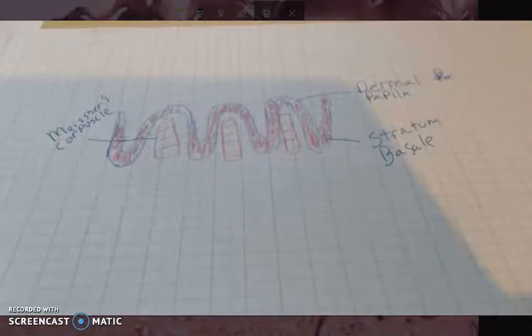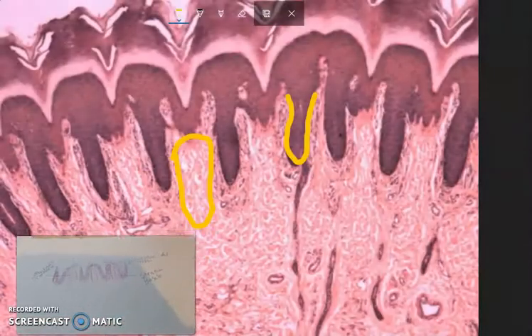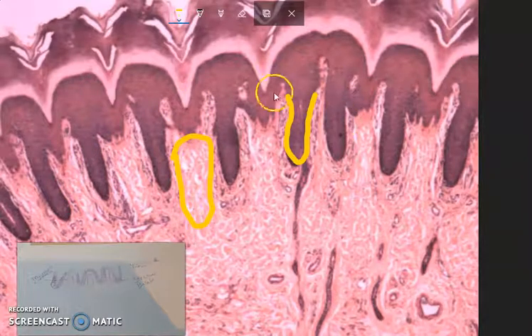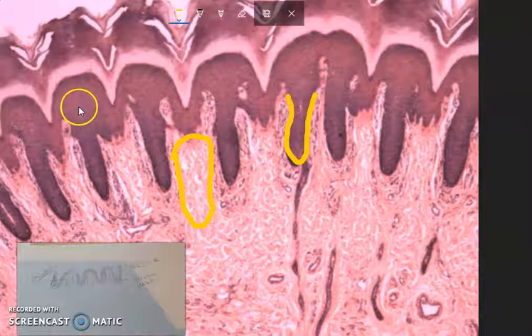Now I'll shade it in pink. And while I'm shading it in pink, I'll do the second row. Now this is a lot darker on this stain, so I'll use a darker pen to shade it in. And this one actually looks easier because I don't really see clear cells. I could see this is my region. That's definitely darker than this. This is definitely my stratum basale. This is my stratum spinosum, but it's on such a low power, I think this is scanning, that I can't really see clearly. So it's going to make drawing easier.